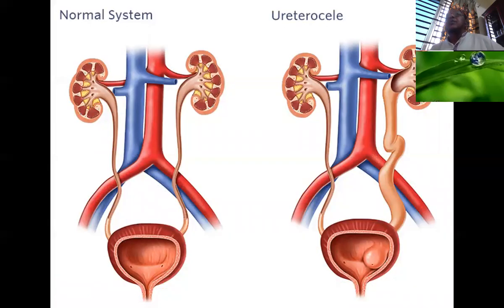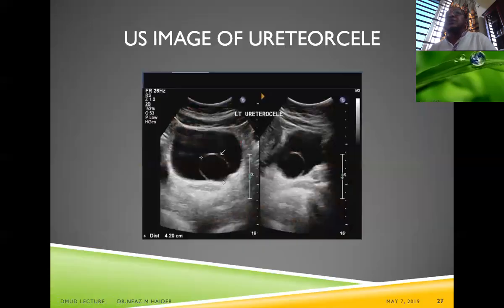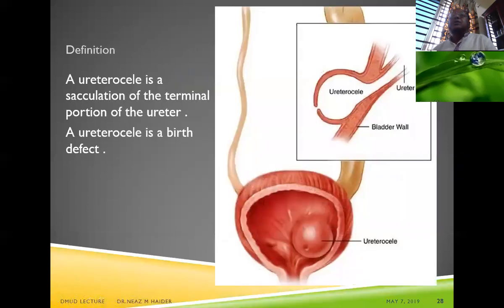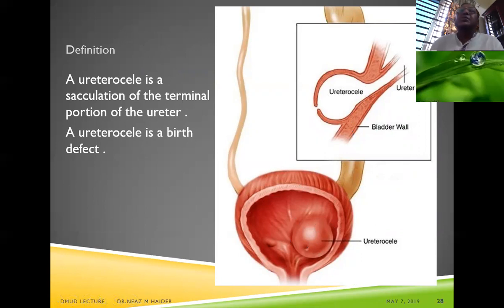The next topic is ureterocele. A large ureterocele within the urinary bladder is shown. By definition, a ureterocele is a cystic dilation of the terminal portion of the ureter. A schematic drawing shows the ureter entering the bladder with the ureterocele and the bladder wall.